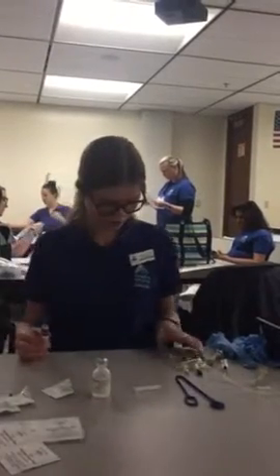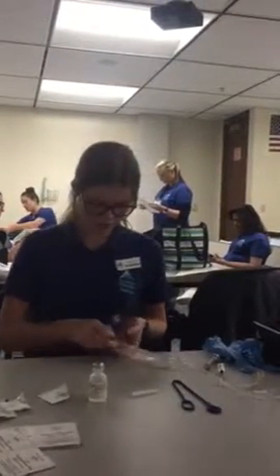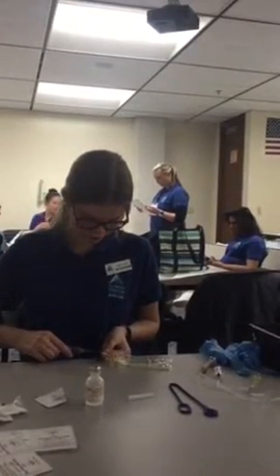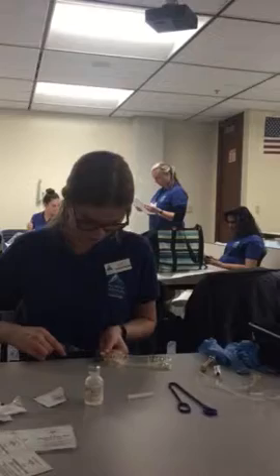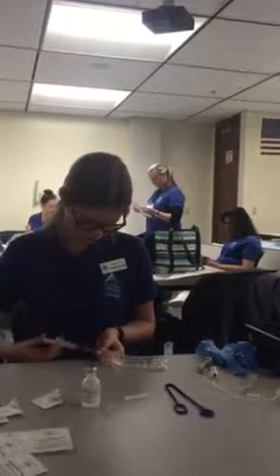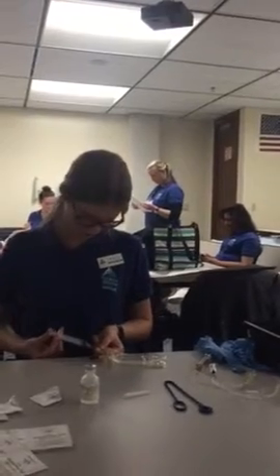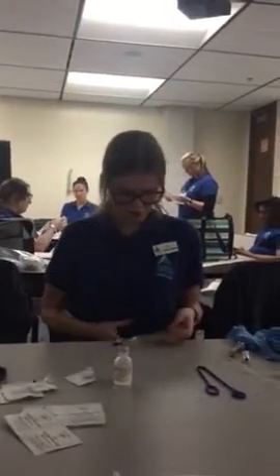Alrighty, and now that we have our medication drawn up, you go ahead and dilute it in the bag. Okay, then you deposit this in the needle box. Now you slightly agitate your medication, and then once it's mixed, you put on your medication label.